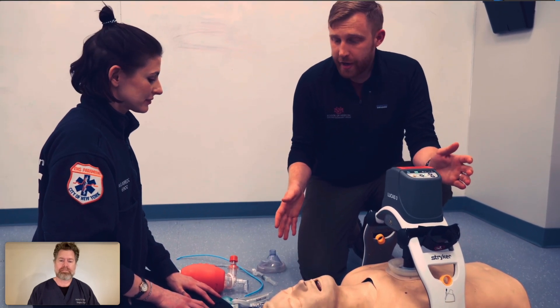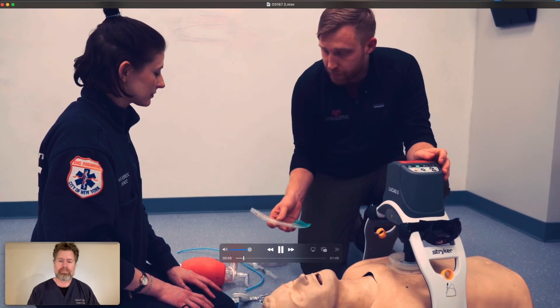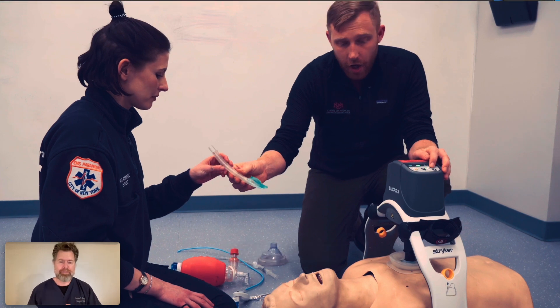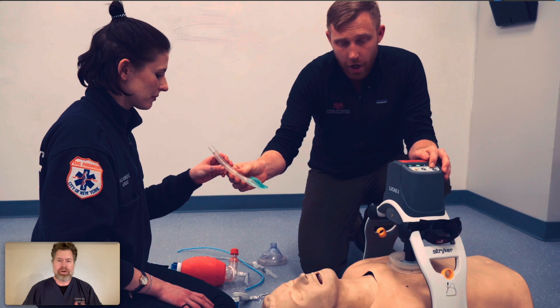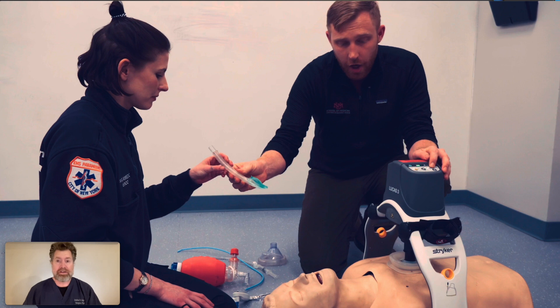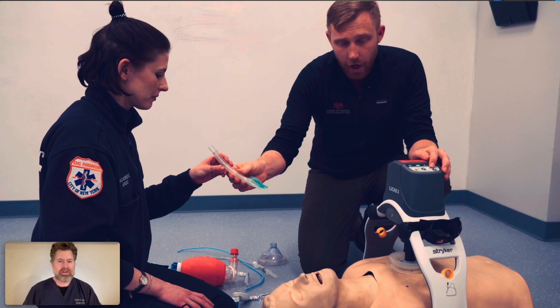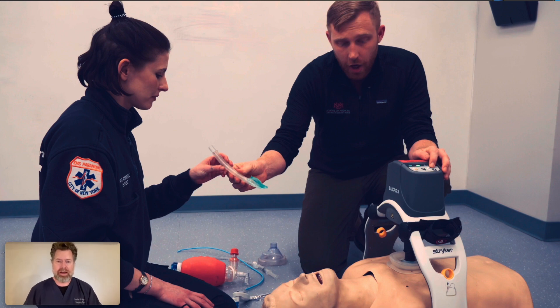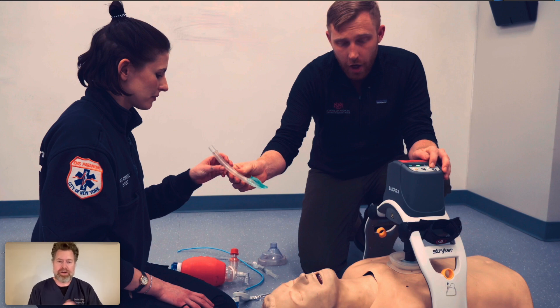We're going to talk about airway management during cardiac arrest. There's ample evidence to show that there's no need to intubate a person during cardiac arrest. Your best initial approach to manage the airway is a supraglottic airway. A supraglottic airway is good, and there's evidence to show that at least in the initial stages of resuscitation this is a great way to resuscitate your patient, provide adequate oxygenation, and focus on high-quality chest compressions without interrupting for intubation. Here we're using an i-gel.